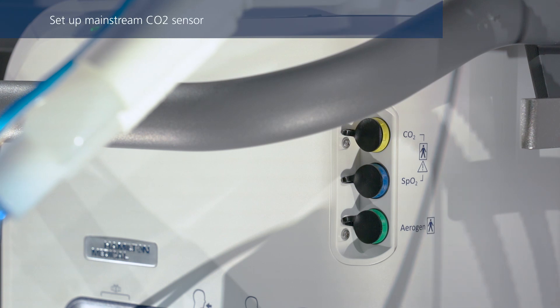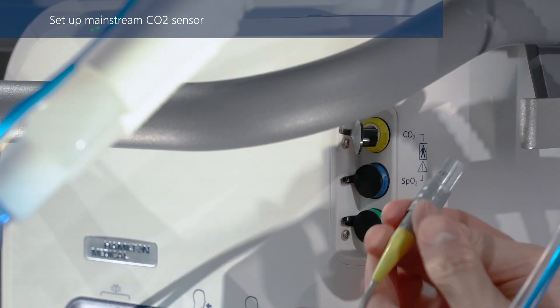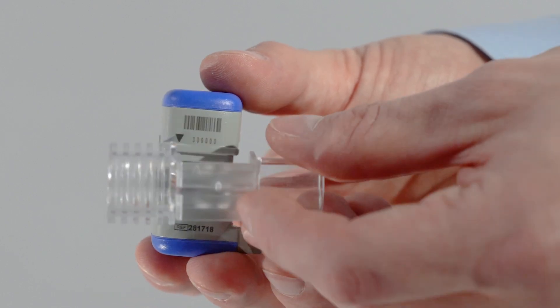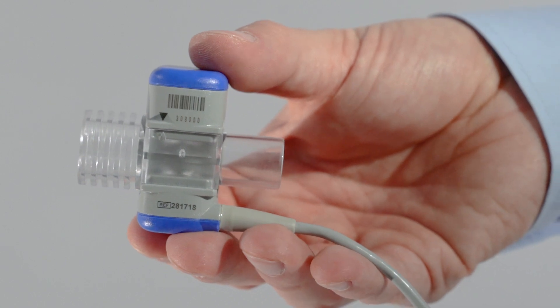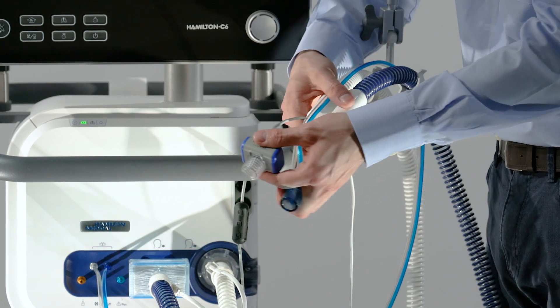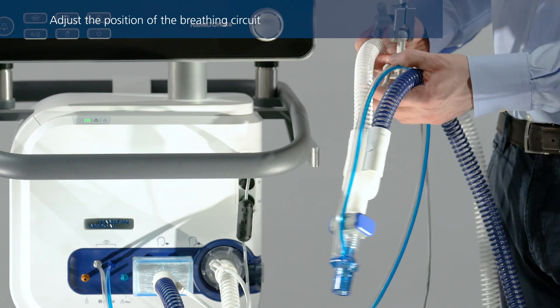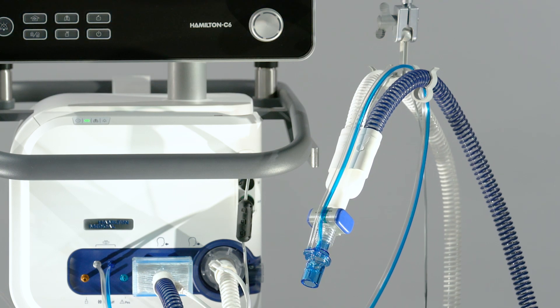If you are using a mainstream CO2 sensor, connect it at this point to the corresponding connection port. Slide the CO2 sensor onto the airway adapter. Align the arrows on both components and press them together until you hear a click. Then connect the sensor with the airway adapter to the breathing circuit before the flow sensor. Position the breathing circuit so that the tubes will not be pushed, pulled, or kinked if the patient moves.